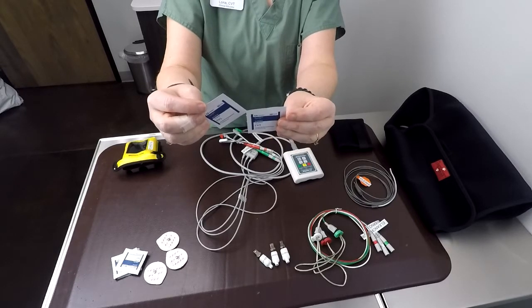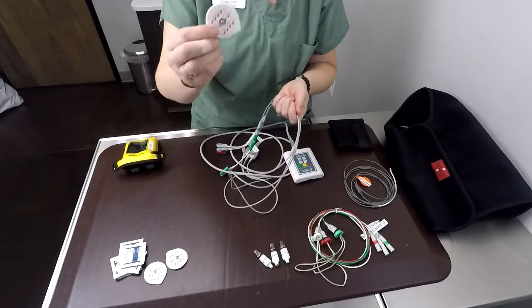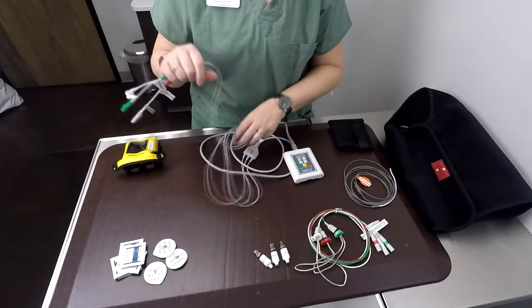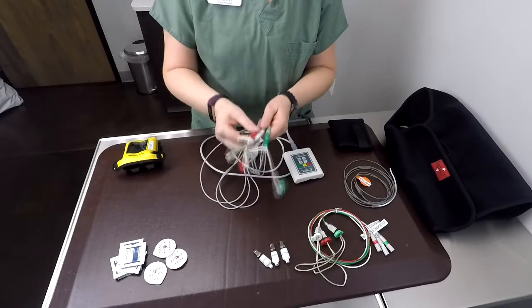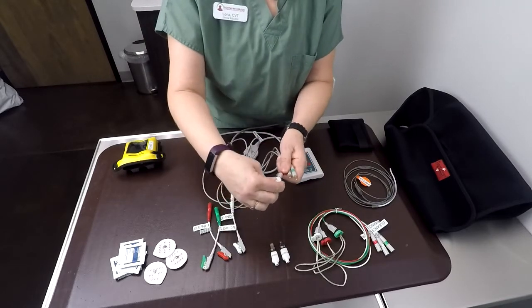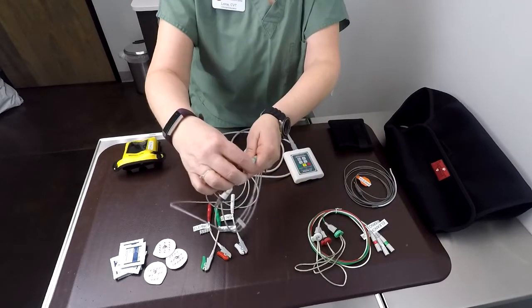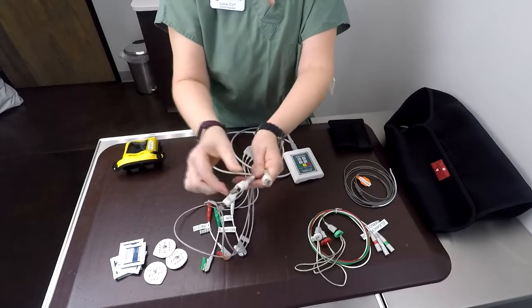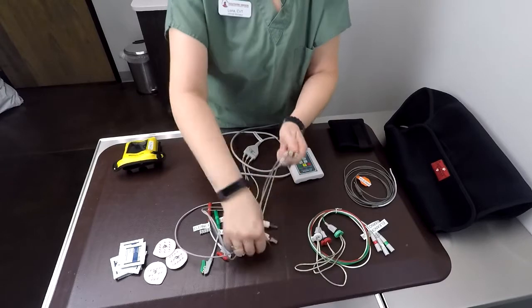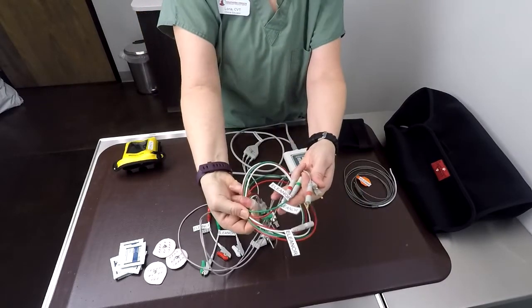In cases where patients have oily skin — such as Shar-Peis — and the electrode pads absolutely will not work, we are maintaining the foot loops and the alligator clips so you can use those instead. These are the alligator clips; they're also labeled. We still have the foot loop option as well, and they are also labeled and color coded.